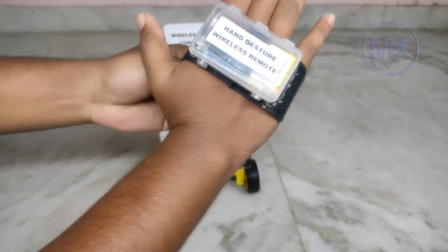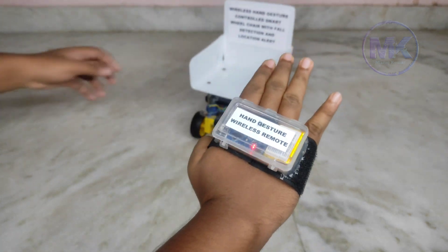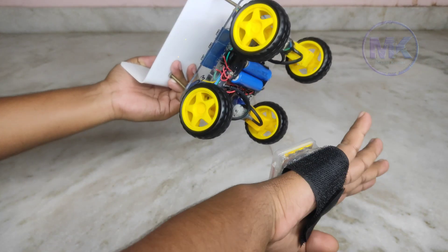Just switch on the remote and it will be activated. We can see that the wheels are rotating and changing their direction according to my hand gestures.